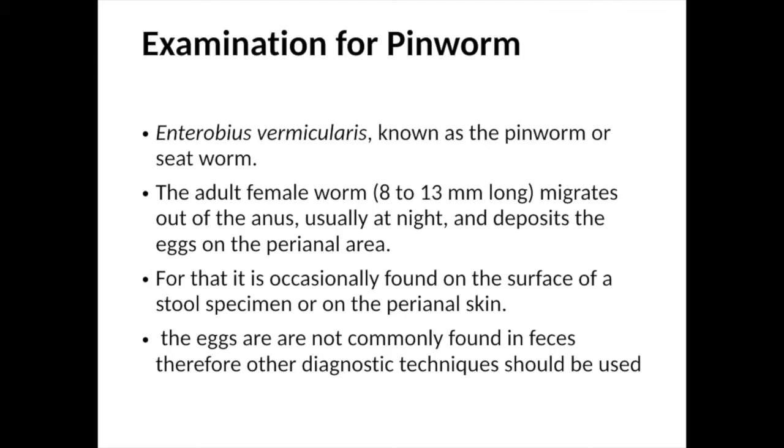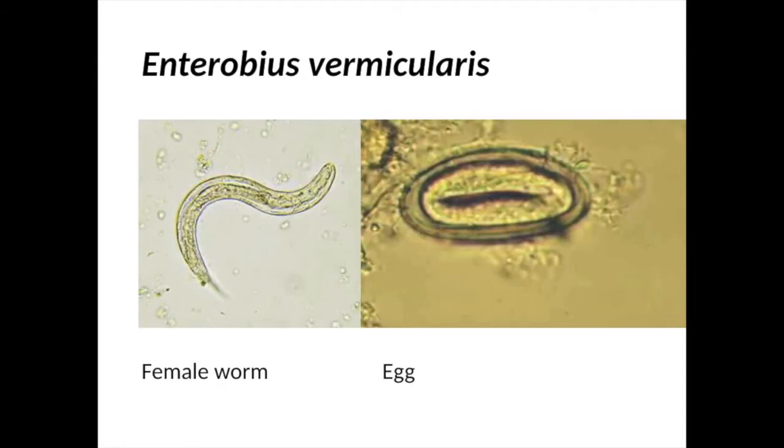We will concentrate on the examination and diagnosis of Enterobius vermicularis, and for that we have to look for other diagnostic methods or techniques. Here you will see the Enterobius vermicularis worm and the egg.